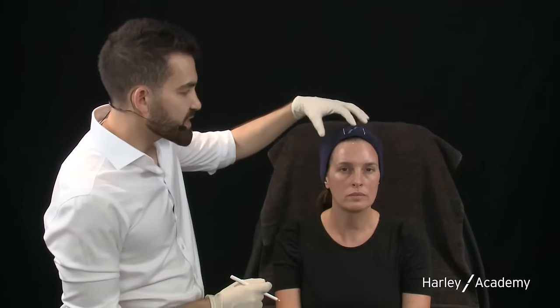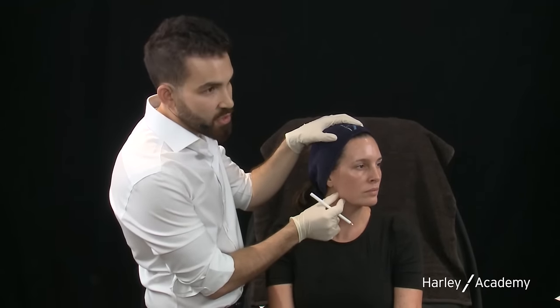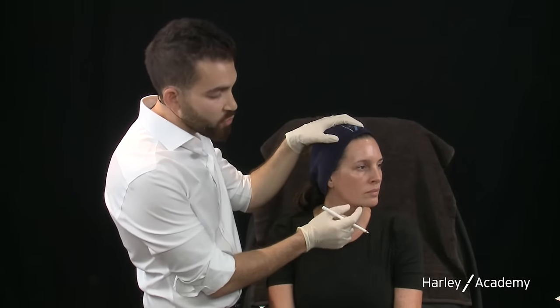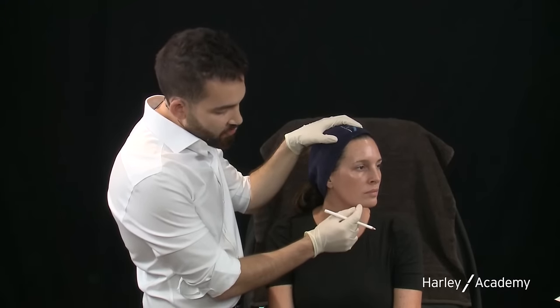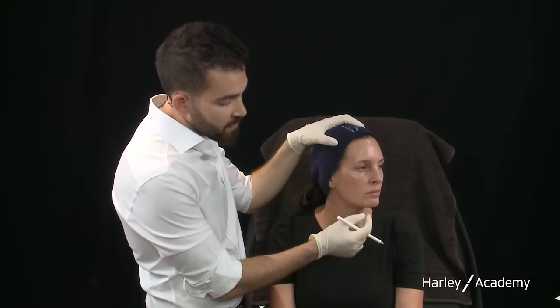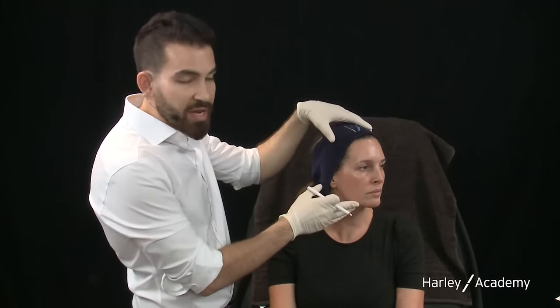We also have to look at the lower third — from the base of the nose to the menton, which is the base of the chin. Marie has a nicely defined jawline, but we can add a little more definition in the corner, which will pull the superficial jowl fat more laterally and create a smoother, more continuous jawline all the way to the chin. I'm also interested in the pre-jowl sulcus — when you compress the tissues there's a break just there — so I'd like to create some deep structure there to transition the chin to the jawline in a more youthful, smooth fashion.